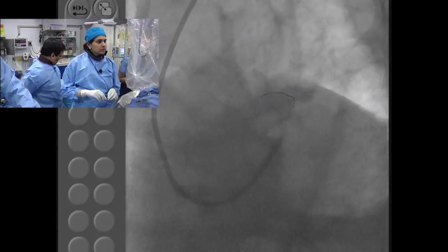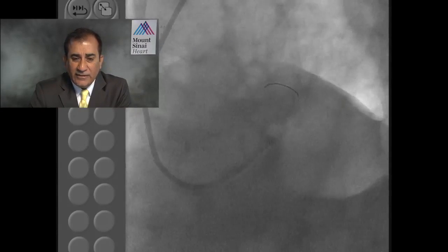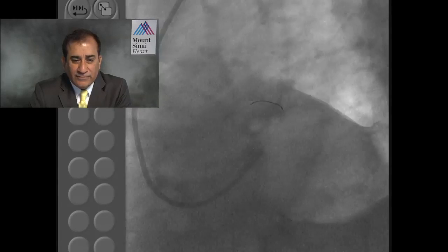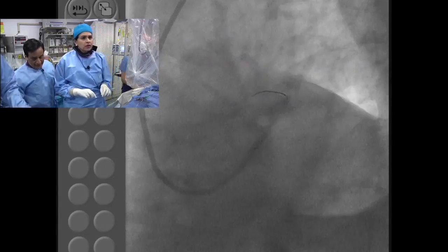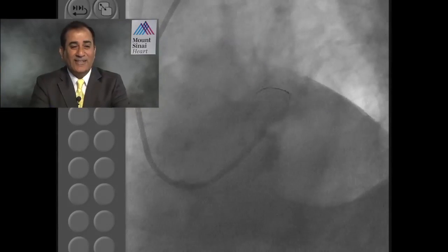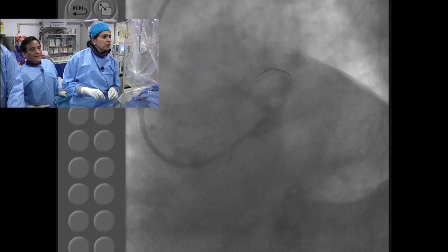So is the CTO requirement in the United States no longer a bilateral cannulation and a Japanese operator? No, that's what I'm saying. Bilateral stays, the Japanese operator is not required.